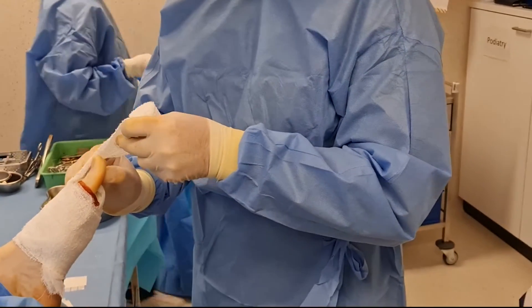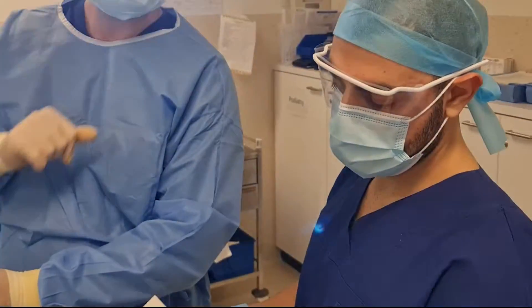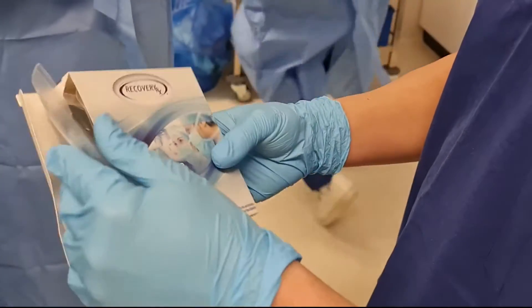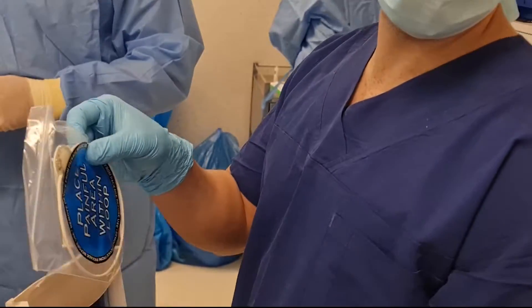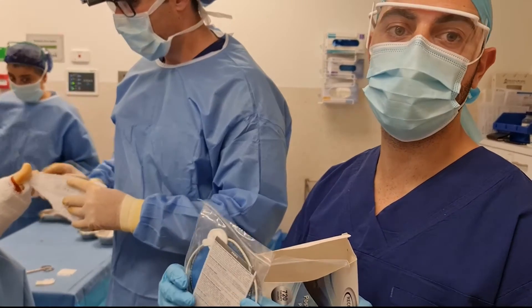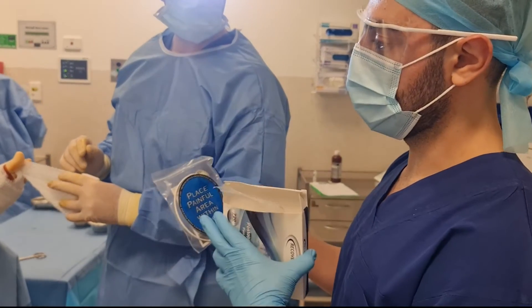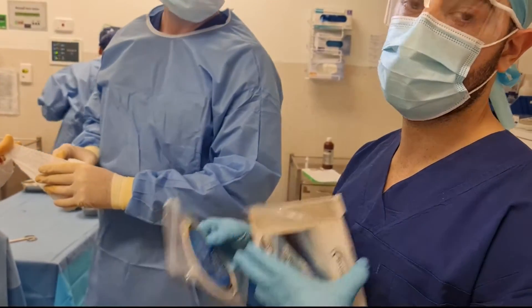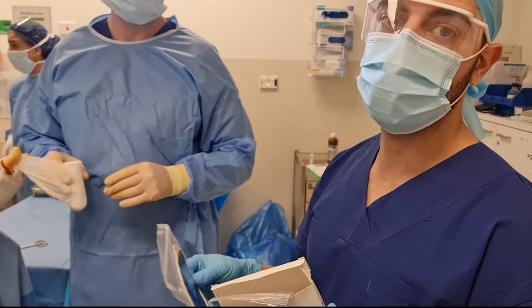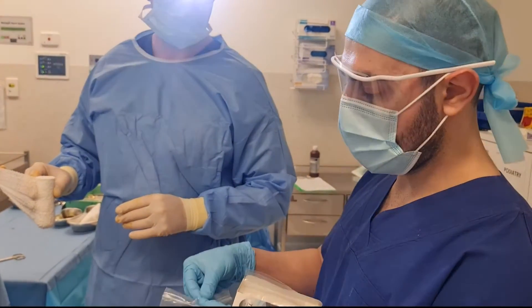Alright, let's get it out and tell me about this thing. So this is Recovery RX. It's a new post-operative pain therapy device. Basically it works via short-wave pulse therapy — electromagnetic frequency waves that get placed into the area where an incision is made or at the site of pain. It actually works to help with acute and chronic pain, reduces sensitivity and inflammation, and helps in post-operative pain recovery. It sends about a thousand pulses per second when turned on.